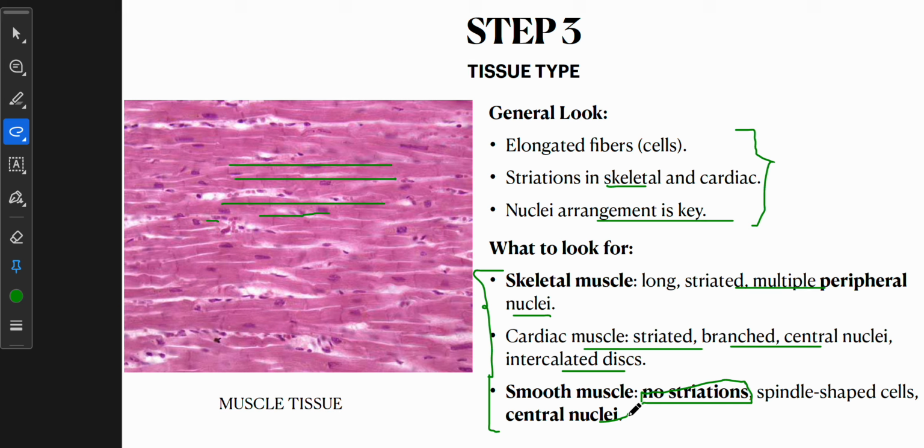If the person presents with leg weakness or extremity weakness, it is obviously a case of skeletal muscle, right? So it is not a case of cardiac muscle or smooth muscle. If there is a case of gastric upset, it is a case of smooth muscle. That is how easy it is. We'll talk about how the objective varies in the upcoming steps.